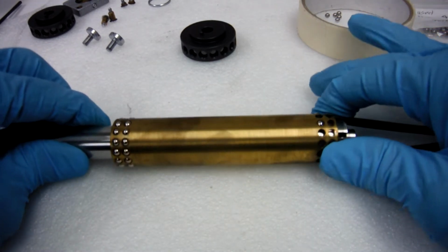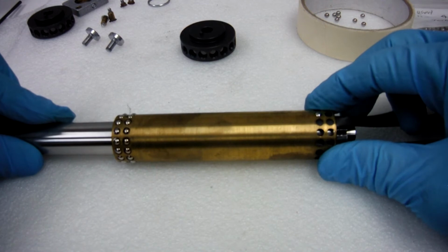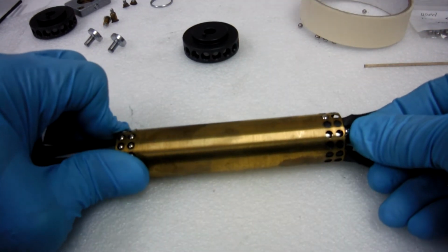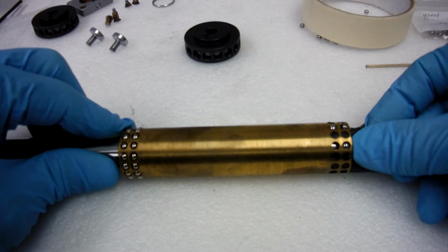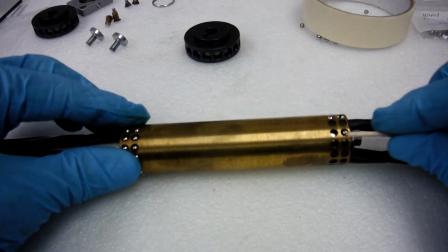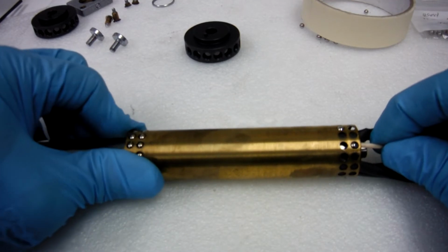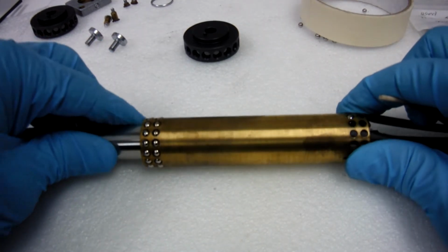Push my axle, turn, do another one. Now notice I'm pushing this slowly as I'm pushing this way, the opposite way, to get that bearing into that second track. Push the axle, turn.